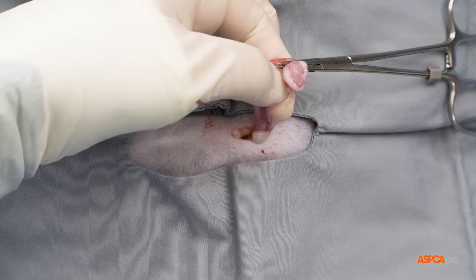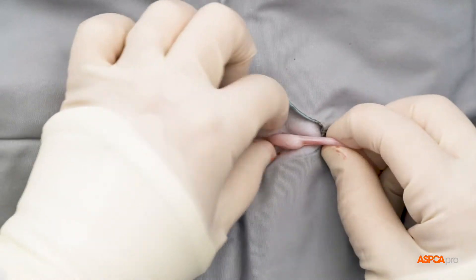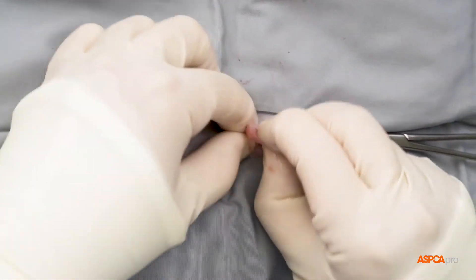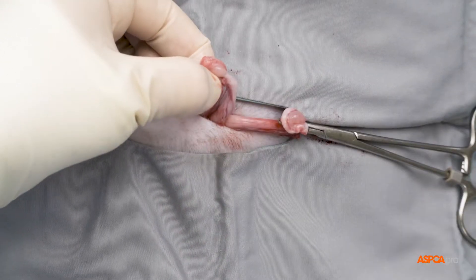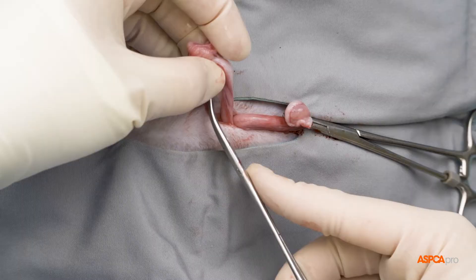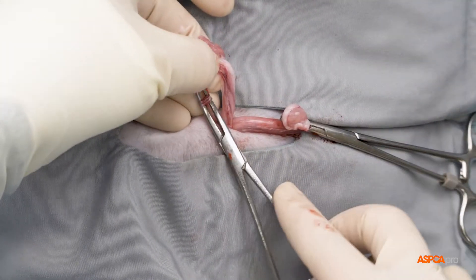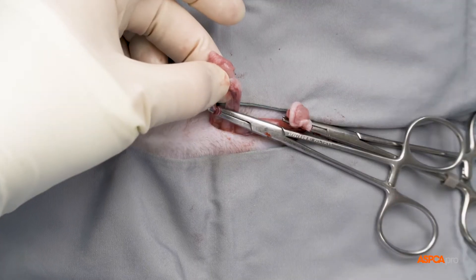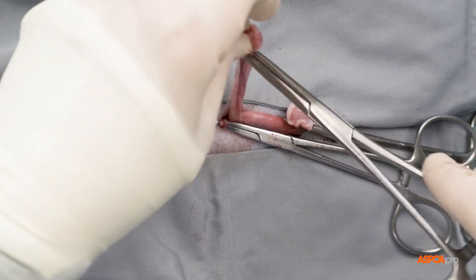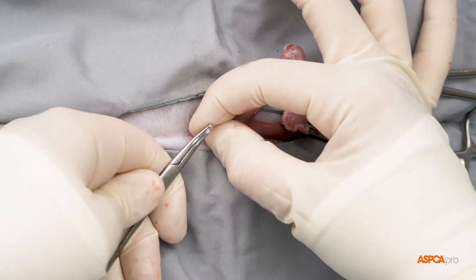Next, the broad ligament is cleared away from the uterine horn. Tracing the tract to the second ovary, the process is repeated: the suspensory ligament is severed, a window is made, the pedicle is auto-ligated, and the ovary is cut away. The knot is secured, and the surgeon confirms hemostasis.